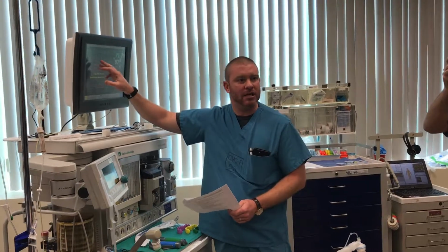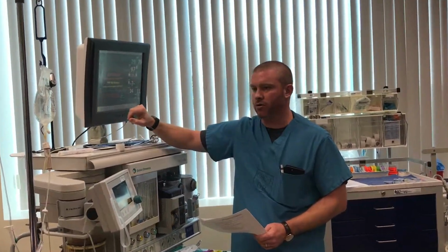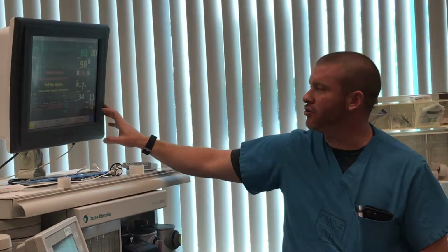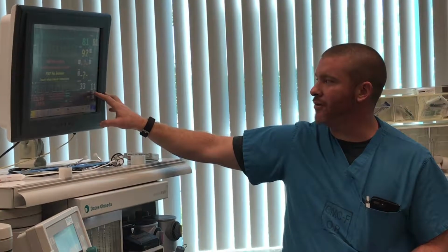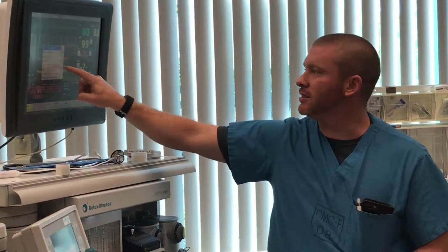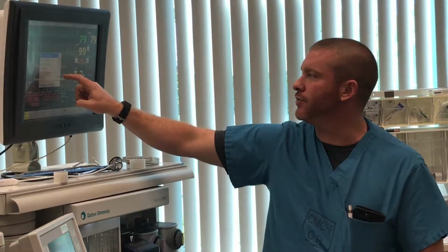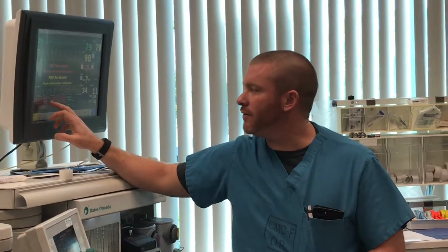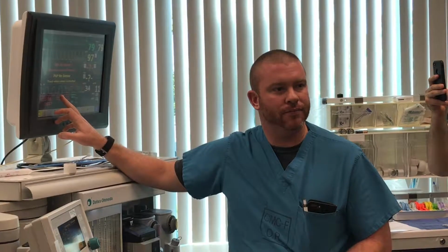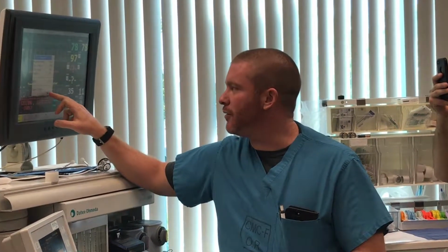You have to tap each one of the things that you need to turn on. You would have to tap the EKG, the blood pressure, the end-tidal CO2. This end-tidal O2 and inspiratory O2, you would have to hit that and turn it on. It looks like this when you come in. You would have to hit on for that to read. With your non-invasive blood pressure, that is the first monitor that you turn on. And why is that the first one we get going? It takes the longest. So I would hit that, it would bring it up, and I would come down here.